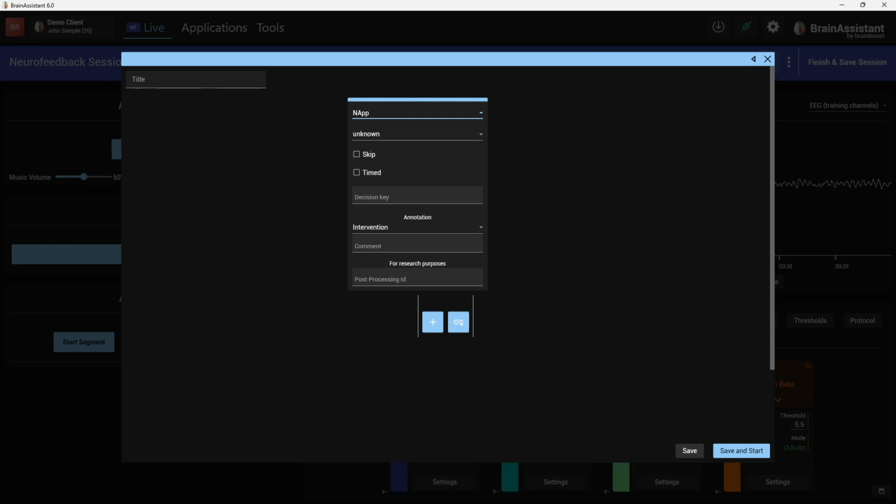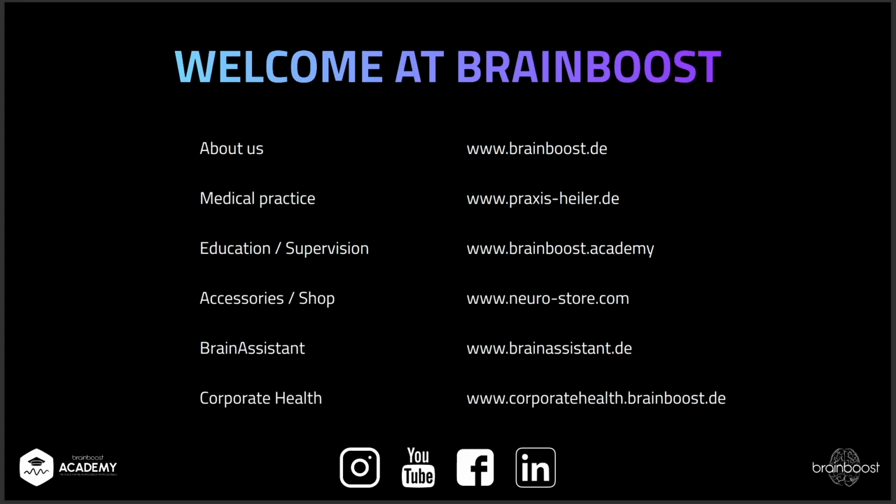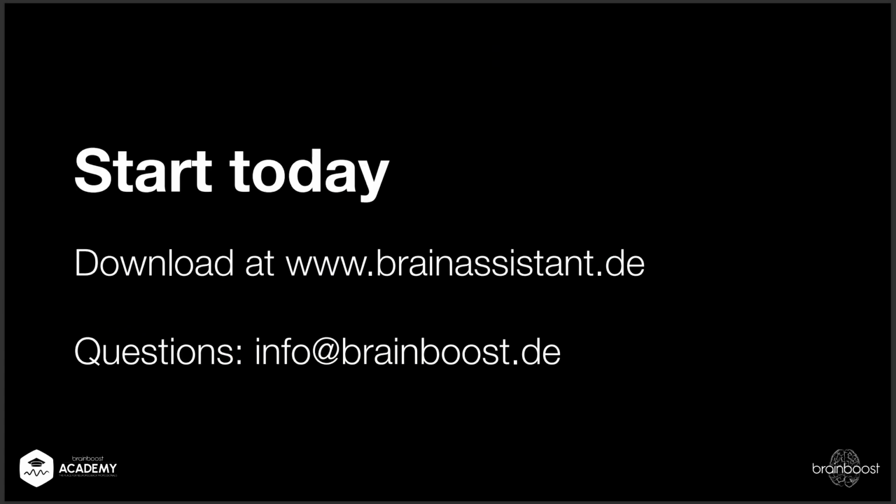So maybe it's also about questionnaires we use a lot and want them also in our Brain Assistant, linked to a date, linked to a session, linked to a patient. So you see all the work we do, we want it in our software and make it as ordered as possible for you to have a very nice ongoing job and focus on the best you can do for your client. Of course, welcome. Take a look at all our websites, but you know this, and start today.